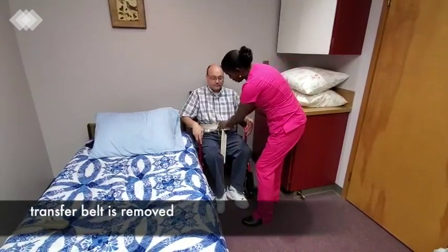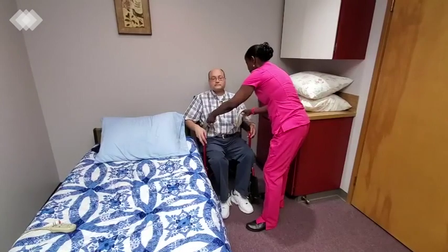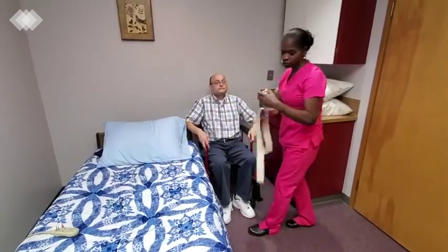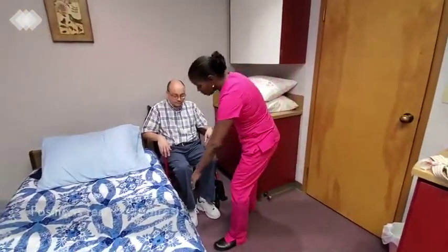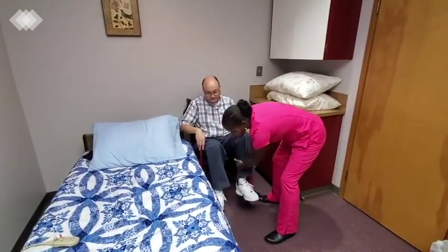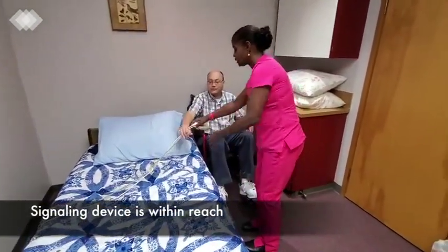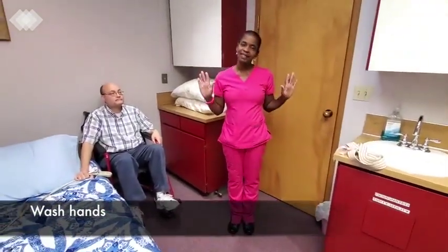I'm going to take off the gait belt now. Let's take this off without shearing your skin. I would like for you to put your feet on the footrest. And here's your other foot for the footrest. And here is your call bell. If you need anything, you're welcome. I'm going to wash my hands and the skill is complete.